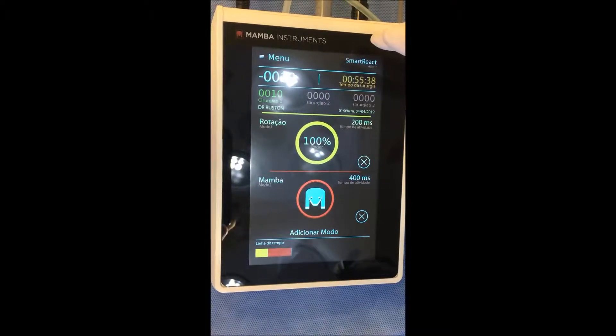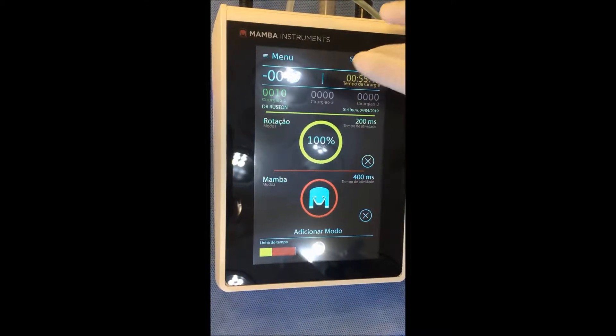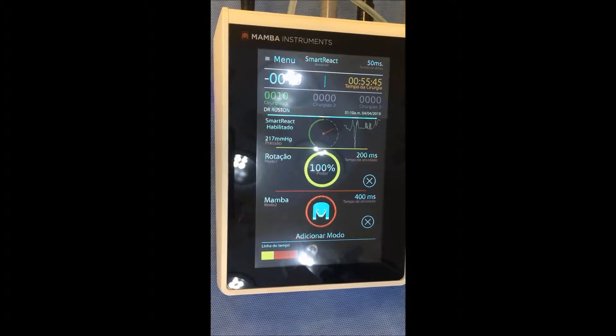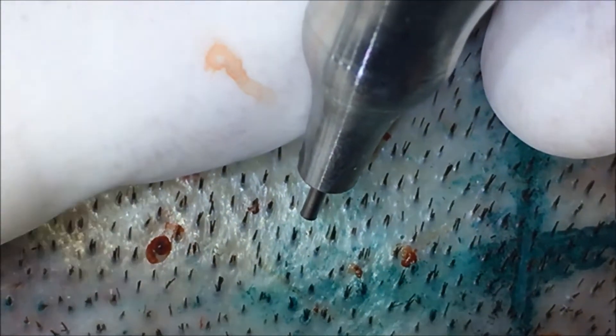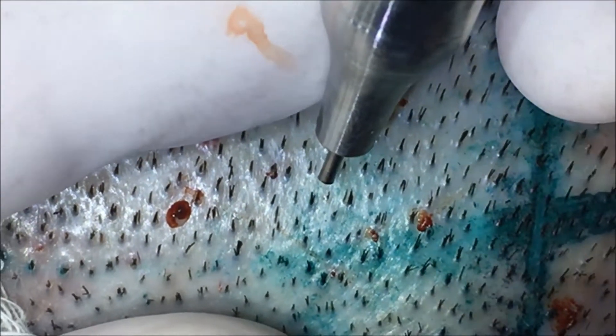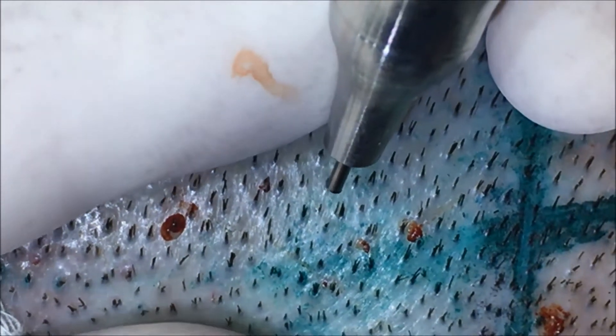On the other hand, when you have speed and accuracy in FUE, you can use the smart reaction instead of the pedal. In smart reaction mode, when the punch touches the skin and makes engagement, the punch starts to rotate automatically without using the pedal.